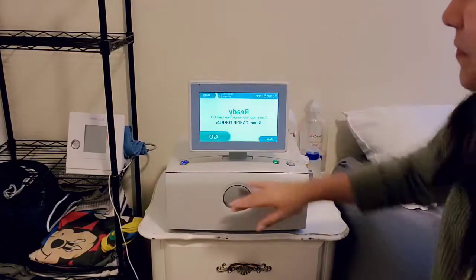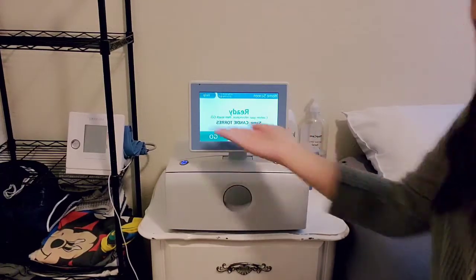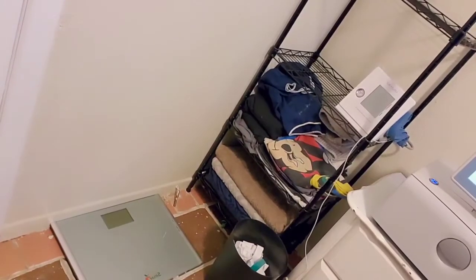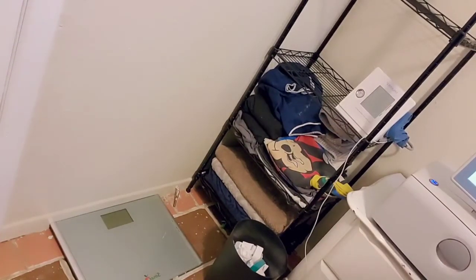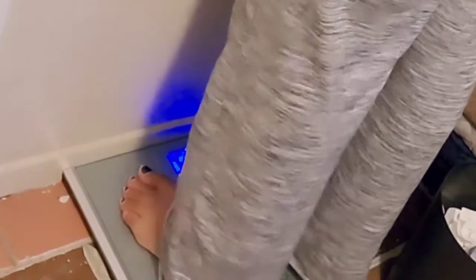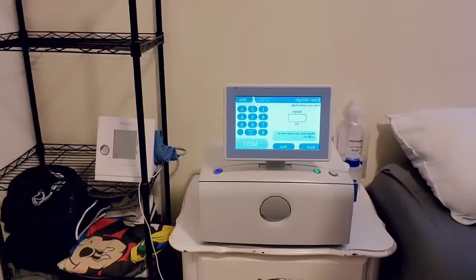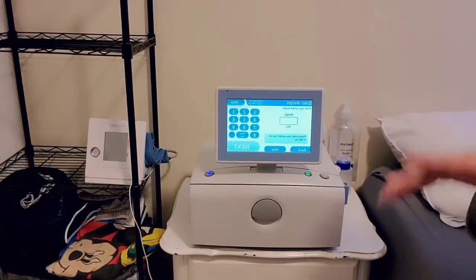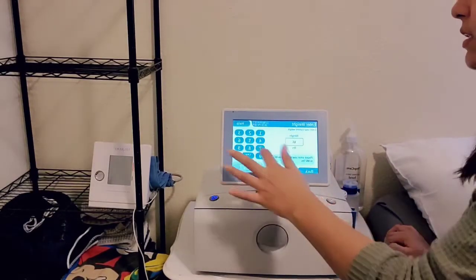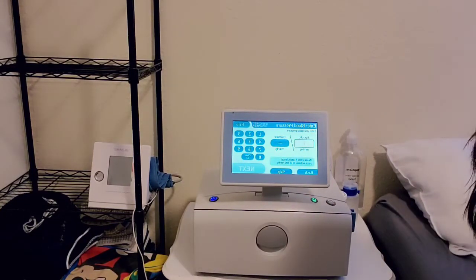It shows my name — confirm your information, then touch go. Now I'm going to take my weight. I keep my scale right next to me, along with all my dialysis stuff I use at night. The scale reads 160.2. The scale and blood pressure machine should have been given to you by your nurse, and if something happens to them you can ask for replacements.